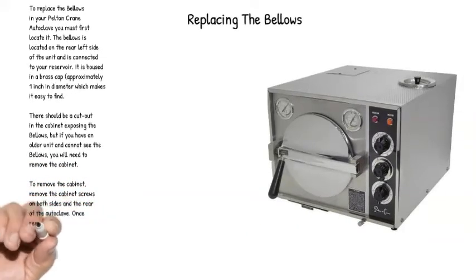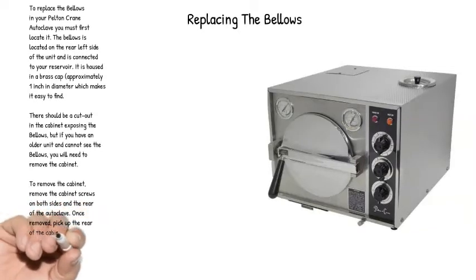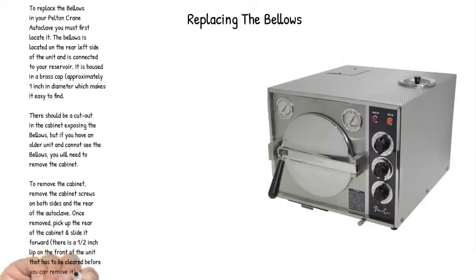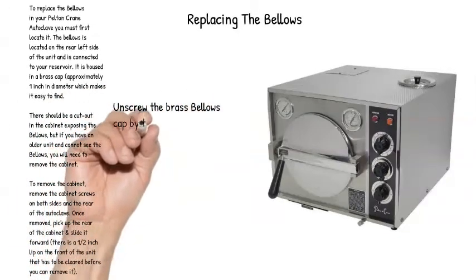To remove the cabinet, remove the cabinet screws on both sides and the rear of the autoclave. Once removed, pick up the rear of the cabinet and slide it forward. There is a half inch lip on the front of the unit that has to be cleared before you can remove it.